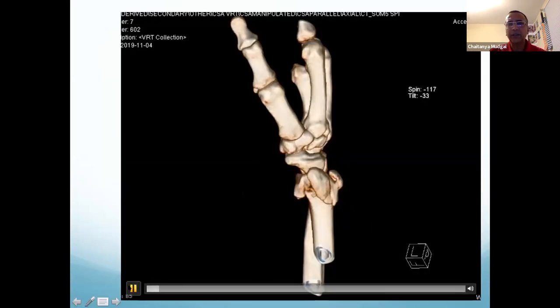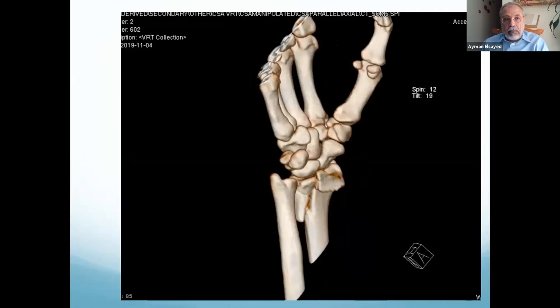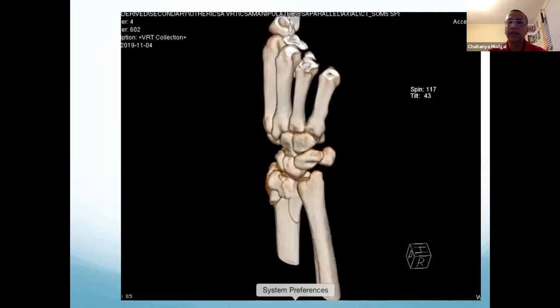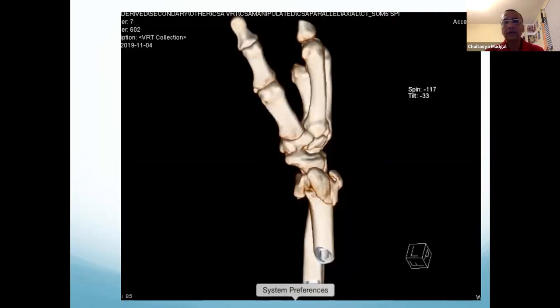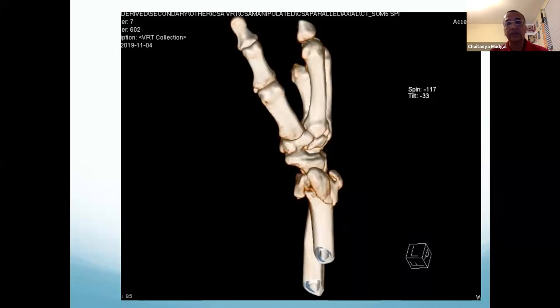So are you able to subtract the carpus? If not, that's fine. No. So in my hands, I would see if I can address this with a volar locking monoblock plate, but I'm not worried if I can't. I would just fix the intermediate column first with a fragment specific plate and then assemble the radial column to it. I would then assess the integrity of the carpus by fluoroscoping the radiocarpal and the intercarpal ligaments and see whether the carpus sits in the cup of the distal radius on the lateral view. If it does reasonably satisfactorily, I don't need to do anything dorsally. But if I need to, I'll open it dorsally.